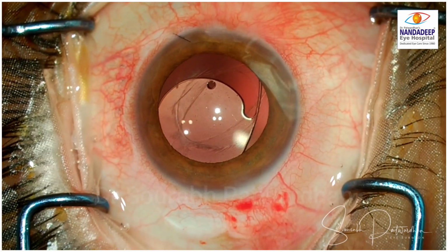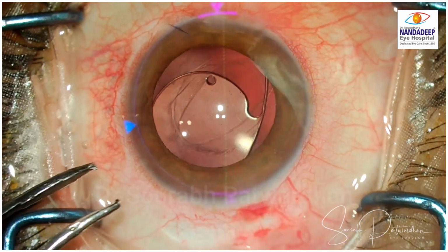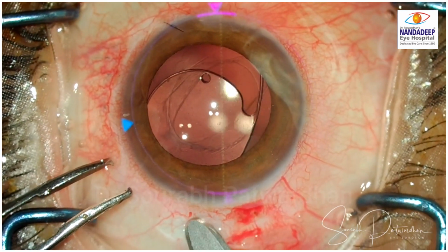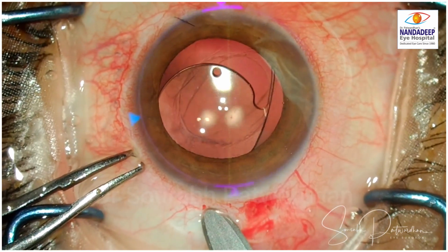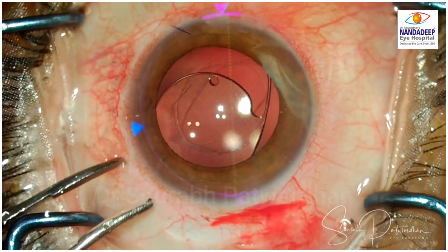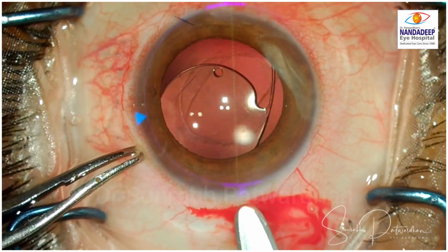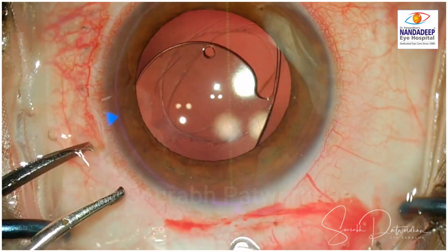Now we commonly use this IOL in India for sulcus placement, as it is the least expensive of all, and we find fairly good results with this IOL, but as you can see, in some cases it may not center very well in the sulcus and may need to be exchanged.